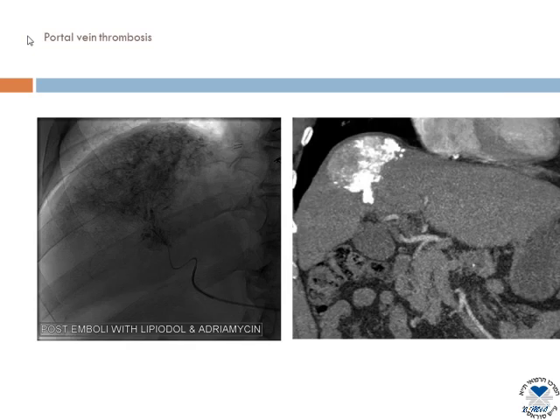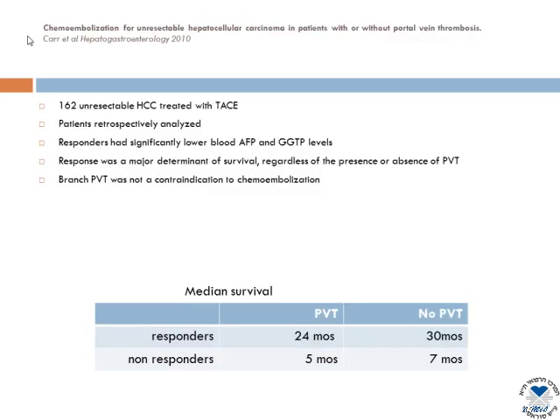Another thrilling topic is the portal vein thrombosis patients. A lot of literature is based on this, whether these patients can be treated safely and in what modalities. This is a beautiful image of the tumor on the apex here, but you can see the extension of Lipiodol into the tumor thrombus into the portal vein in a fashion called string sign. And the follow-up CT is also concordant with this. You can see the Lipiodol going down into the portal vein very efficiently. So portal vein invasion is by no means a contraindication anymore.